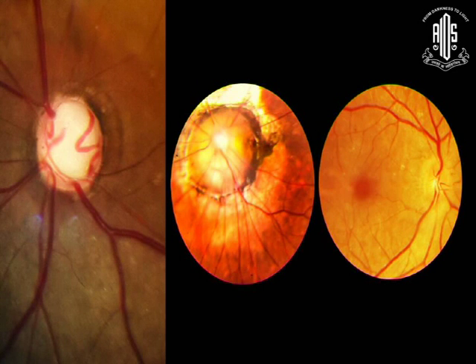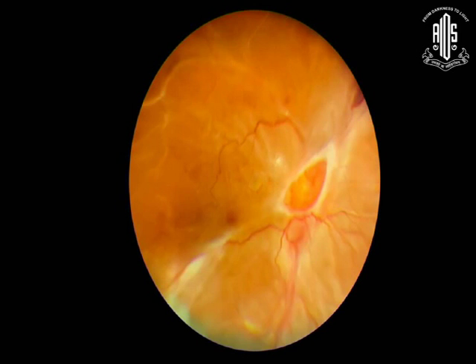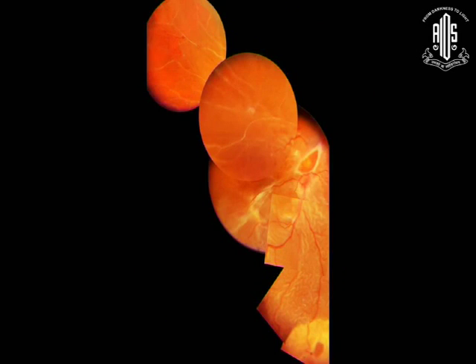And this is again a fundus periphery showing 3 horseshoe tears. The ora serrata is here, and the pars plana is beyond this area. So you can go up to that area again. This is a patient with combined rhegmatogenous and traction retinal detachment, and I have taken a montage from the superior retina to the inferior. So all the way from up to down, you can image with this device. And this is the retinal break, the traction component of the combined retinal detachment.